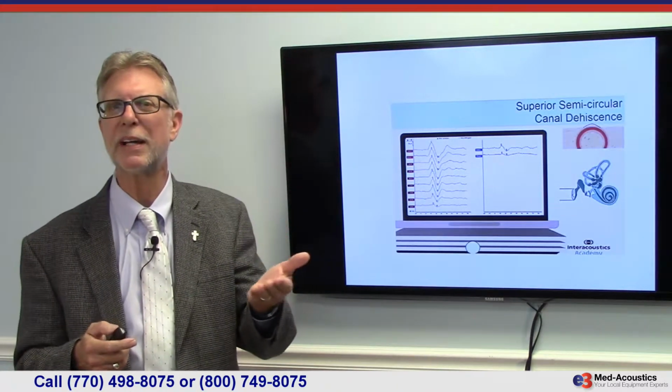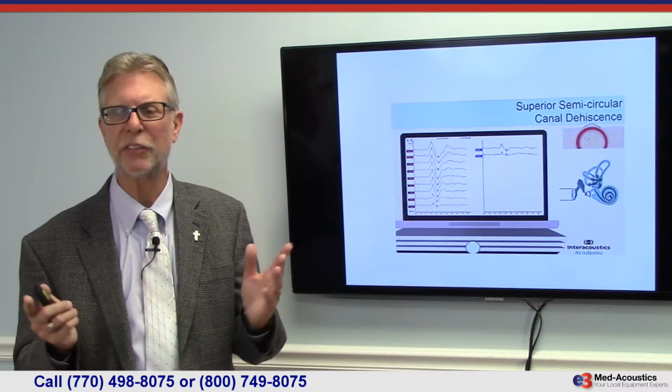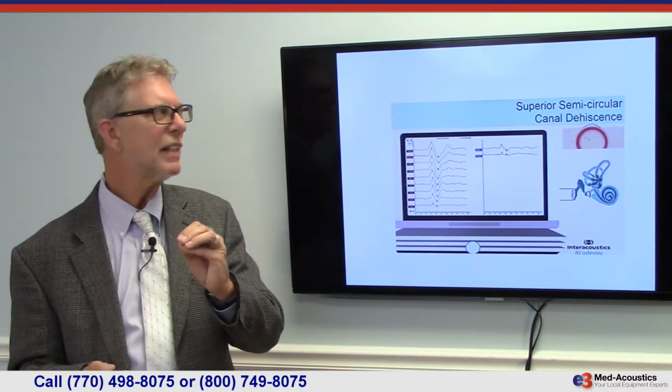When you get down to 90, you're about at threshold. Move down to 85 or 80, it's gone, unless there's superior canal dehiscence. You have an enhanced response.